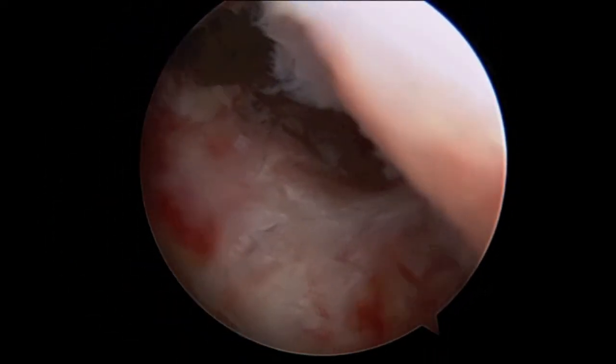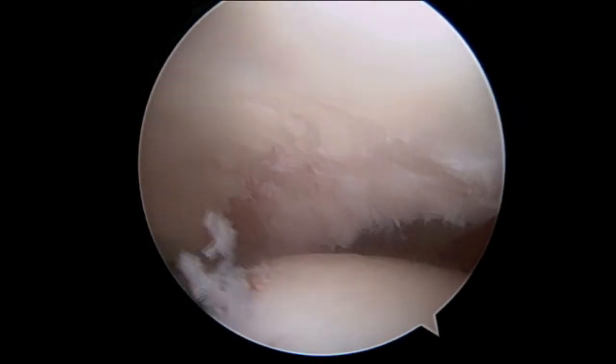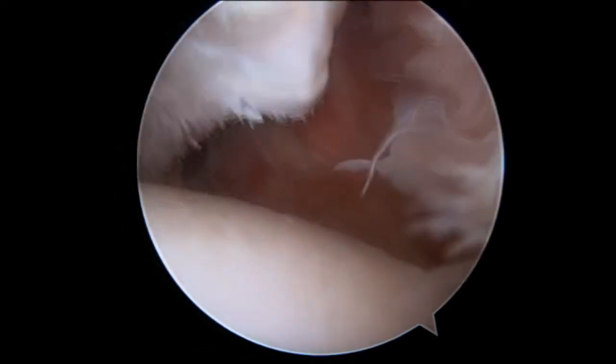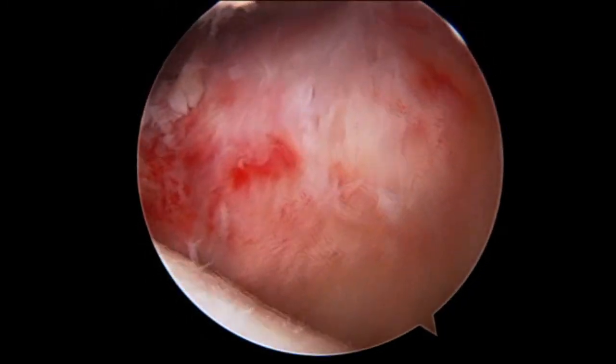Now we are looking down the front of the socket from a superior or overhead view. There is a clear indentation to the lower right portion of your screen in the front edge of the socket, indicating that too much bone has been lost from the edge of the socket.